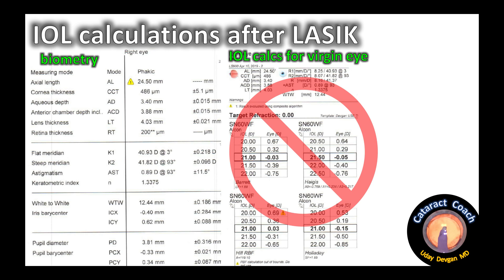On this biometer there are two rings, each with 16 points — a total of 32 points — measured at about the 2mm range from center. Pupil data, white-to-white, and other parameters are also provided. On the right side of the page, there is a big red warning sign through the standard IOL calculations — we don't want to use those, because that printout shows lens calculations for a virgin eye, and we don't have that. We have an eye with prior LASIK.